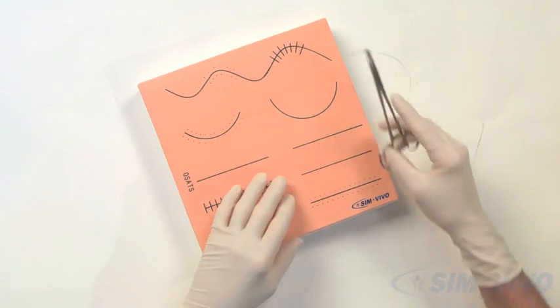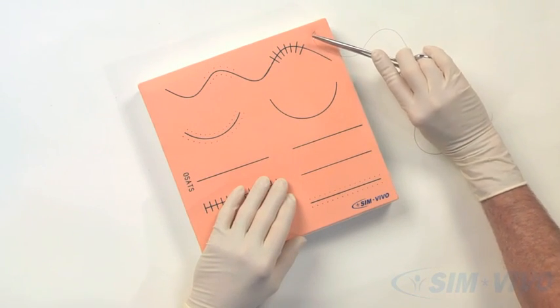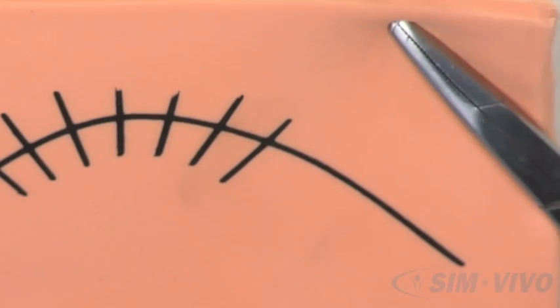Needles can be carefully disposed of by deeply embedding them in an unused space of the suture board and cutting off any residual suture material.